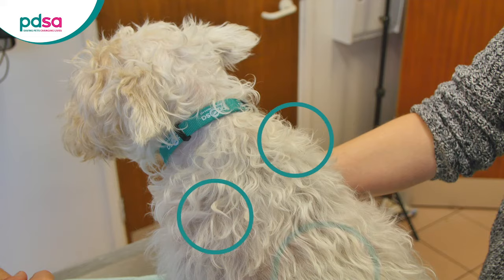When you're familiar with the process, rotate the injection site so that the skin does not become too thick in one area over time. For example, you could inject over the shoulders or the lower back.